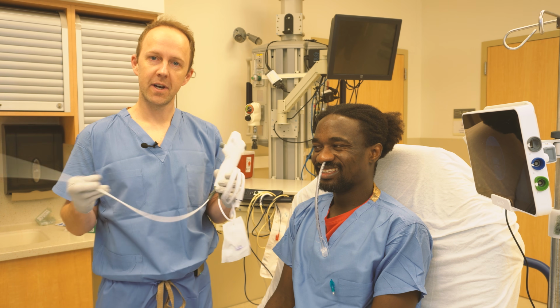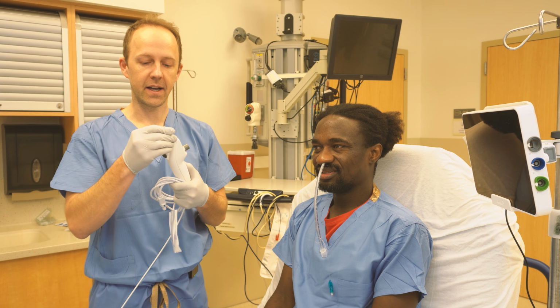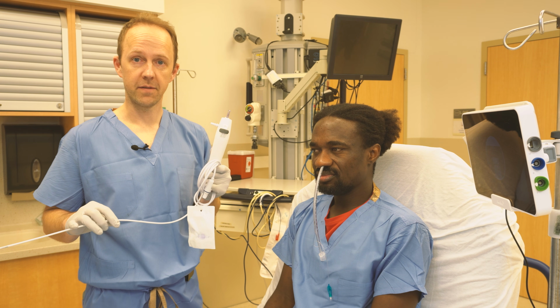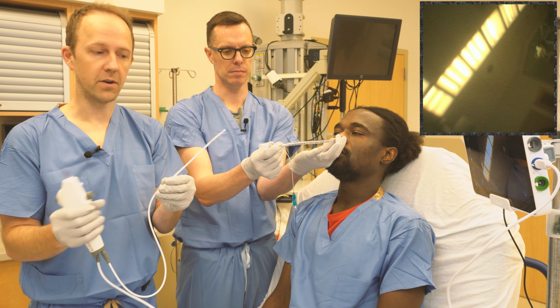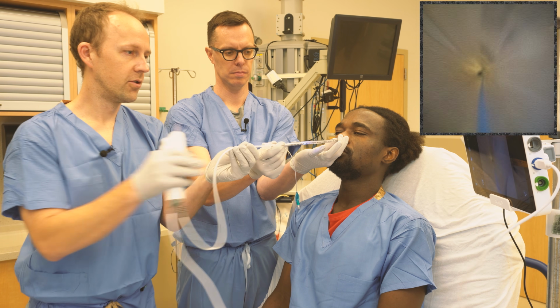Okay, so this is the scope we're going to be using today, 3.8 outer diameter scope with a luer lock adapter that goes right here so you can administer local anesthesia through the scope when you're hovering above the cords. Okay, so the next step is to insert the scope into the tube. The tube should be hovering roughly above the vocal cords. It helps to put a thin layer of lubrication on the scope to help it pass through the tube easily.